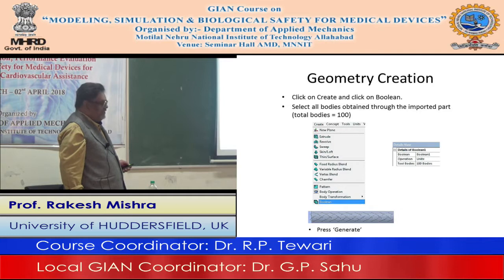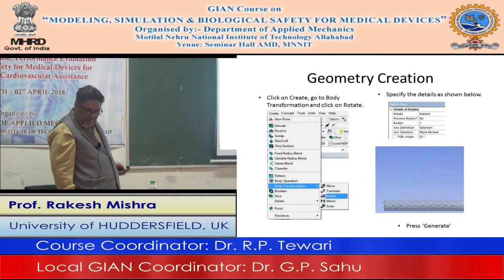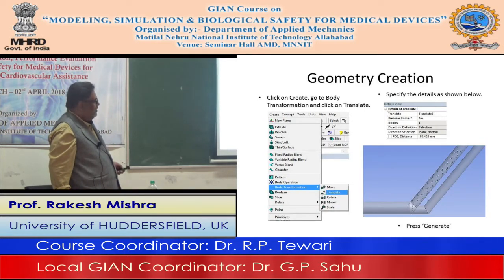And if we rotate it by 53 degrees, you remember the arteries are at 53 degrees after the intersection. So I rotate it by 53 degrees. So when I rotate it by 53 degrees, it is aligned along one of the bifurcated arteries here. So what is happening? It is coming somewhere here, and I am rotating it by 53 degrees. So what happens? It is here now. It was here. Now I have rotated it by 53 degrees, it has come here.